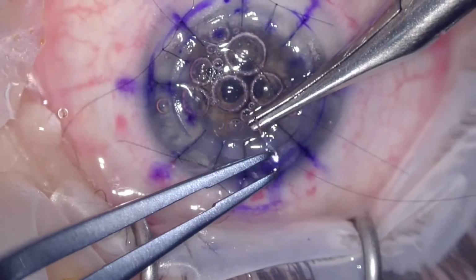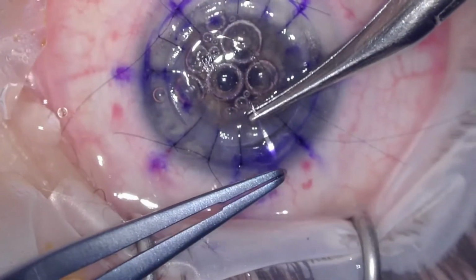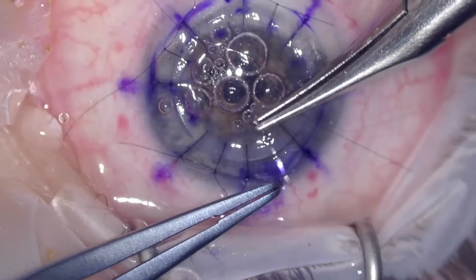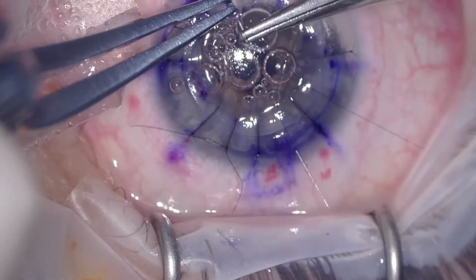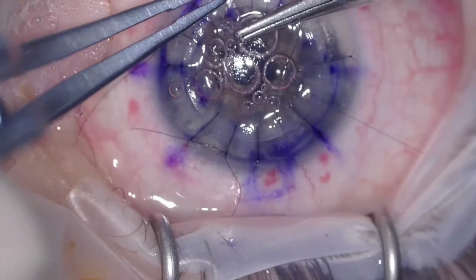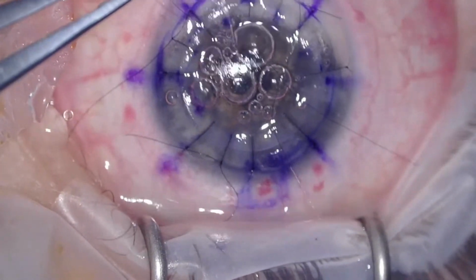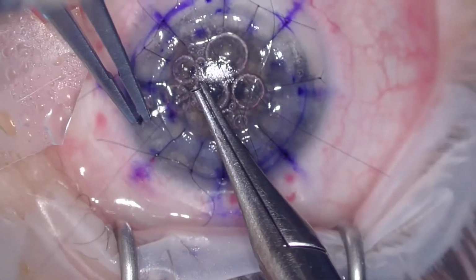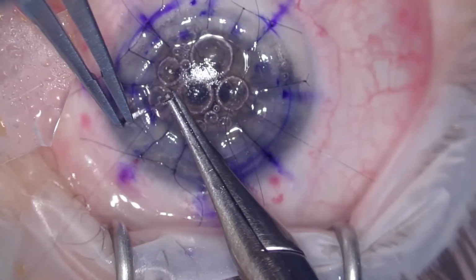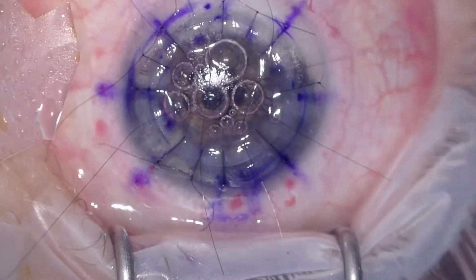Now my tendency for DALK cases is to over tighten the sutures because I want this graft to push into the host bed and not for it to protrude outwards. So I have a tendency to cause flattening of the cornea after the deep anterior lamellar keratoplasty while the sutures are in, and when the sutures come out, the patient tends to get a steepening of the cornea from the initial flattening, which tends to give a good visual outcome.